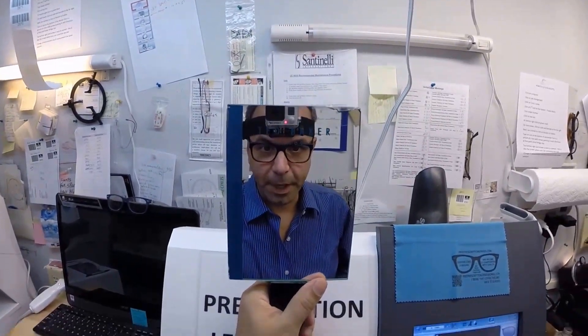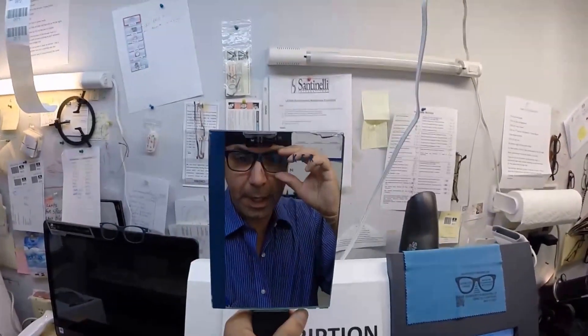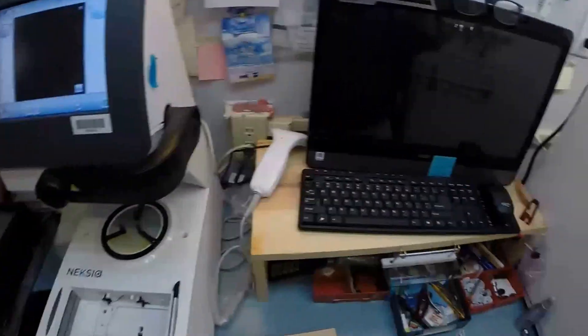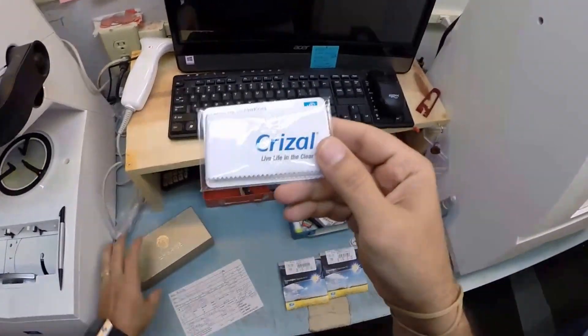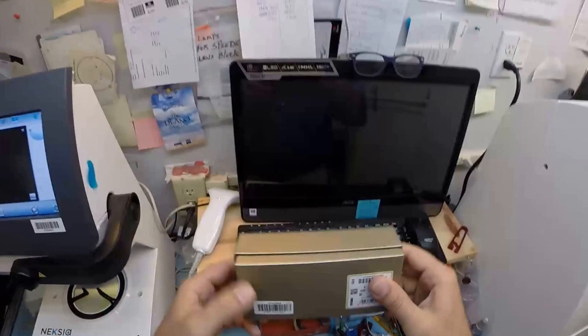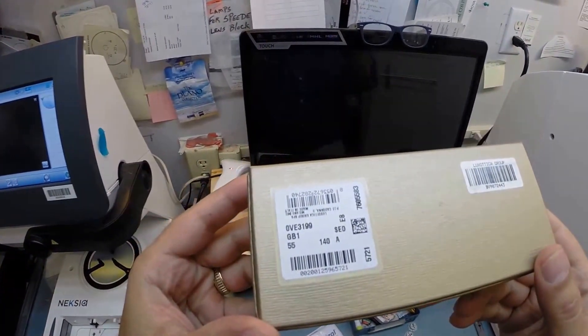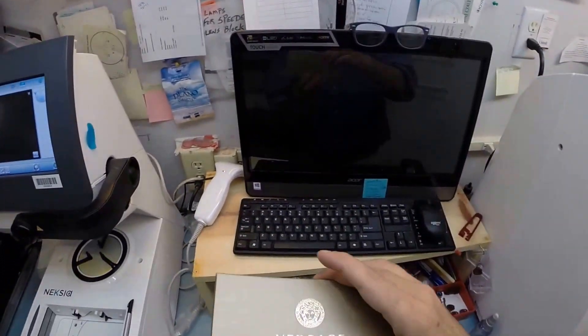Hey Reed in Sanford, North Carolina. Matthew here with FreePrescriptionLenses.com. You want to be like me, you want to get a pair of Versace's like I'm wearing. I'll do it for you. I will cut prescription lenses with Transitions Gray and Crizal for your new Versace. They are the 3199 color GB1, which is the solid black, and the 55 eye size. So let me begin.